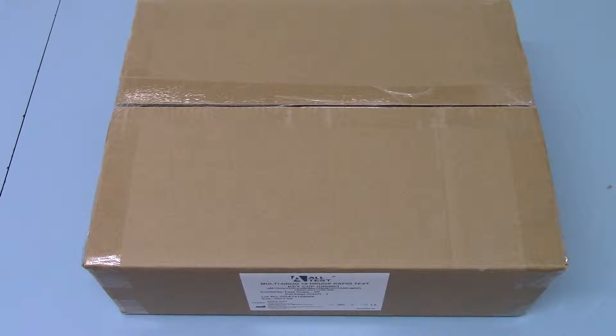Welcome to this presentation and product demonstration video for the AllTest Multidrug 10 Drug Rapid Test.